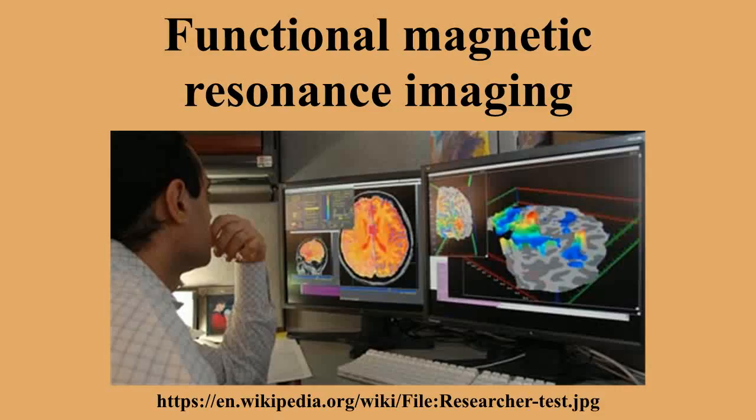The primary form of fMRI uses the blood oxygen level dependent contrast discovered by Seiji Ogawa. This is a type of specialized brain and body scan used to map neural activity in the brain or spinal cord of humans or other animals by imaging the change in blood flow related to energy use by brain cells. Since the early 1990s, fMRI has come to dominate brain mapping research because it does not require people to undergo shots, surgery, or to ingest substances, or be exposed to ionizing radiation, etc.